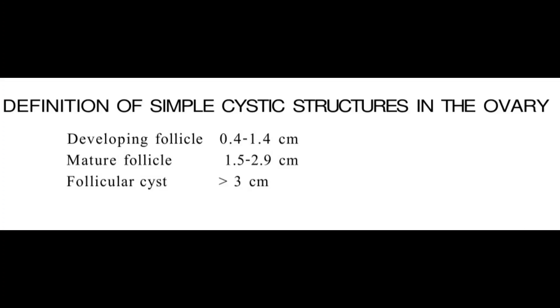When the follicle matures, its size becomes 1.5 to 2.9 centimeters — less than 3 centimeters is considered a mature follicle. If the size increases beyond 3 centimeters, it is considered a follicular cyst and falls into the category of a cystic lesion. Do not confuse clinicians or gynecologists by labeling follicles as cysts without knowing the size thresholds.